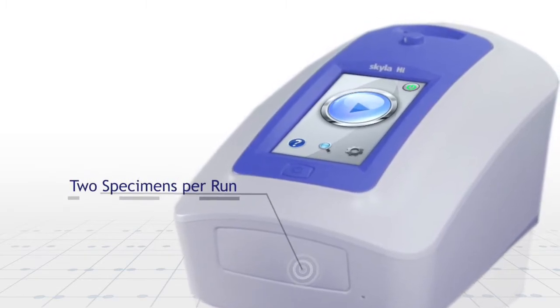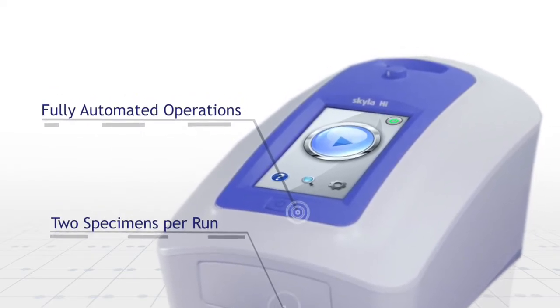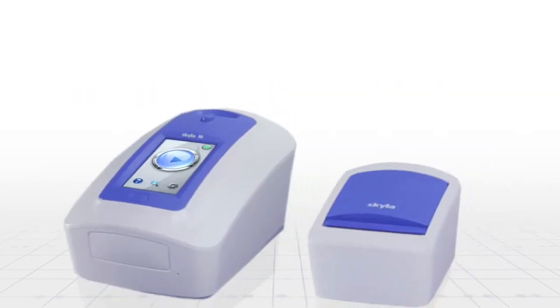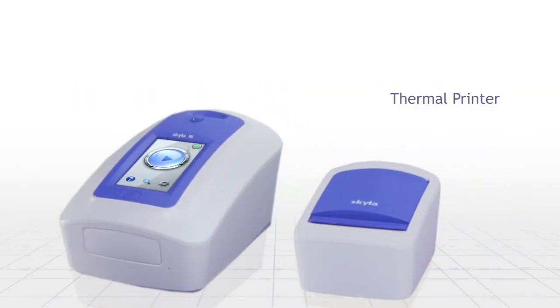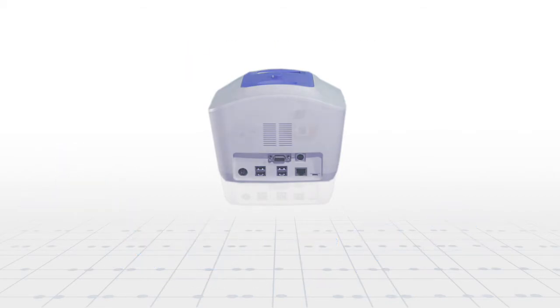Two specimens test per run, fully automated operations, user-friendly design, and Skyla self-developed data management software make Skyla HI enhance point-of-care testing application.